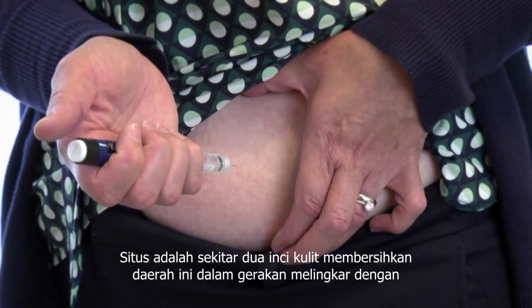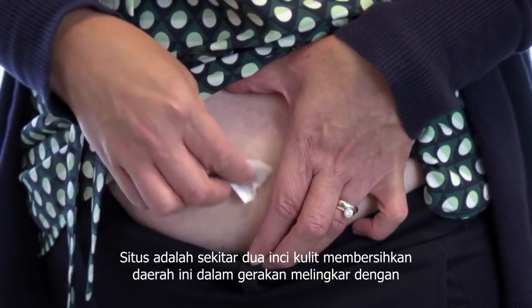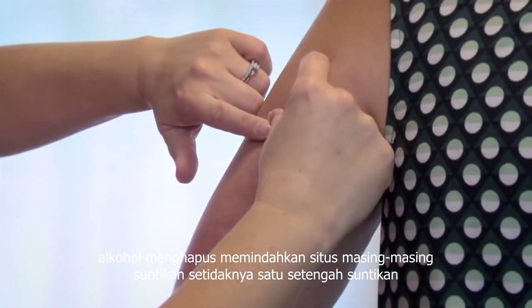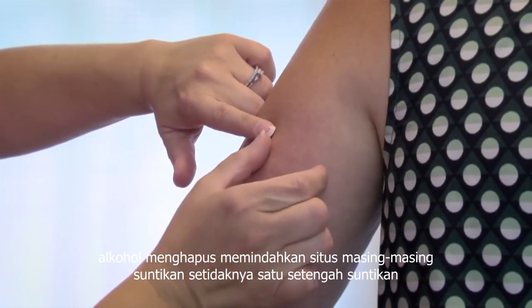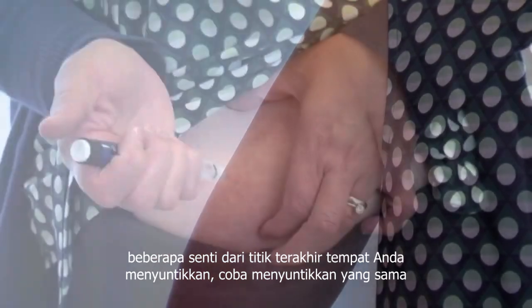The injection site is about 2 inches of skin. Clean this area in a circular motion with an alcohol wipe. Move the site of each injection. Inject at least 1.5 inches away from the last spot where you injected.